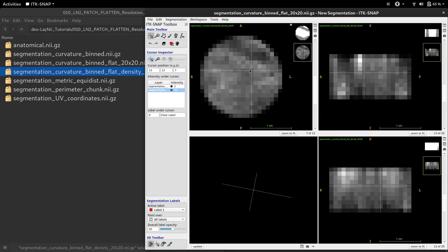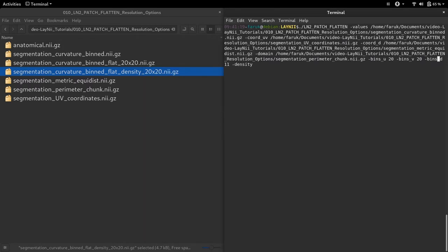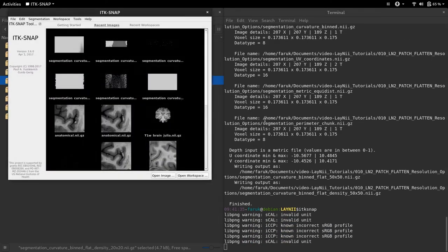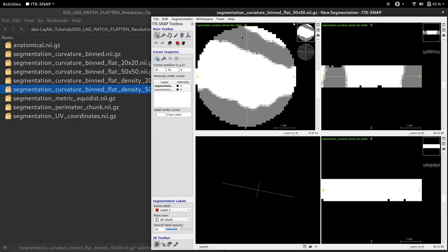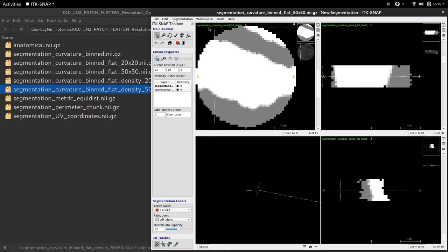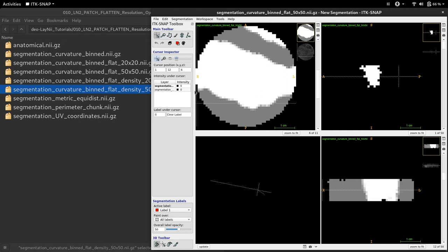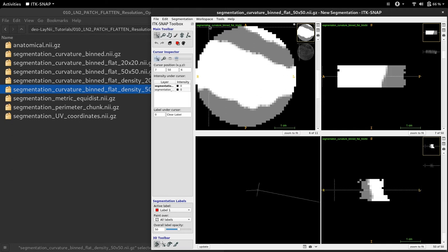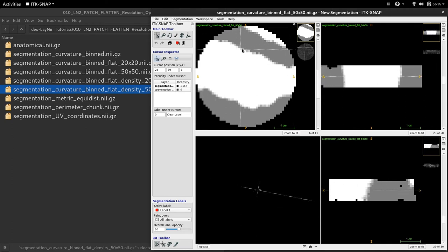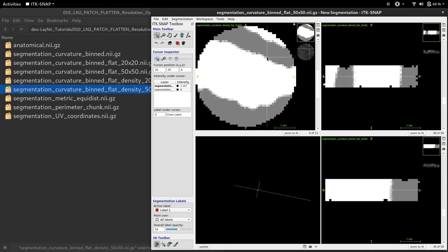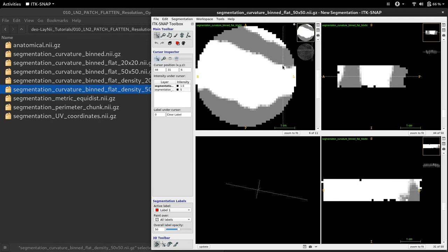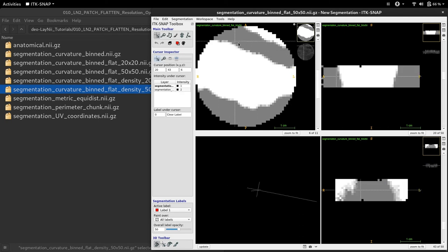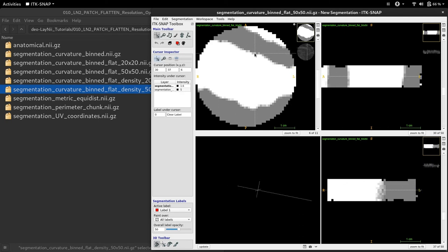Let's see what will happen when I increase the number of bins. Here I'm going to use 50 bins for U, 50 bins for V, and I'll keep the depth the same at 11 bins. It's finished. Let's have a look at the result. Now you can see that on the X and Y axis in this flat representation, instead of 20, I have 50 bins. The transition parts of my binned curvature become a bit sharper, less blurry.